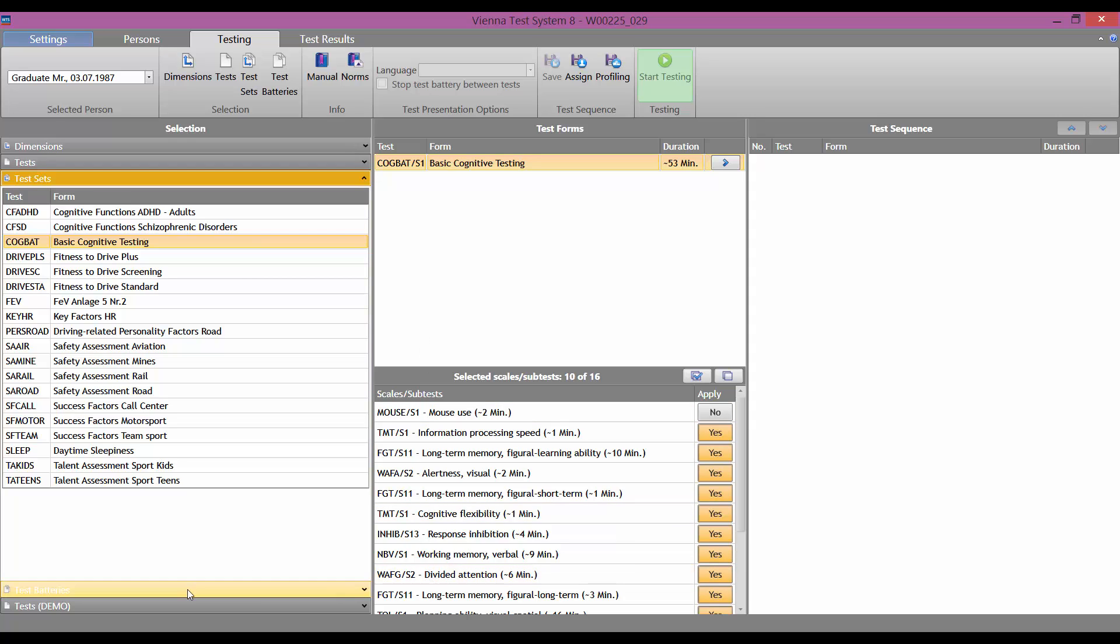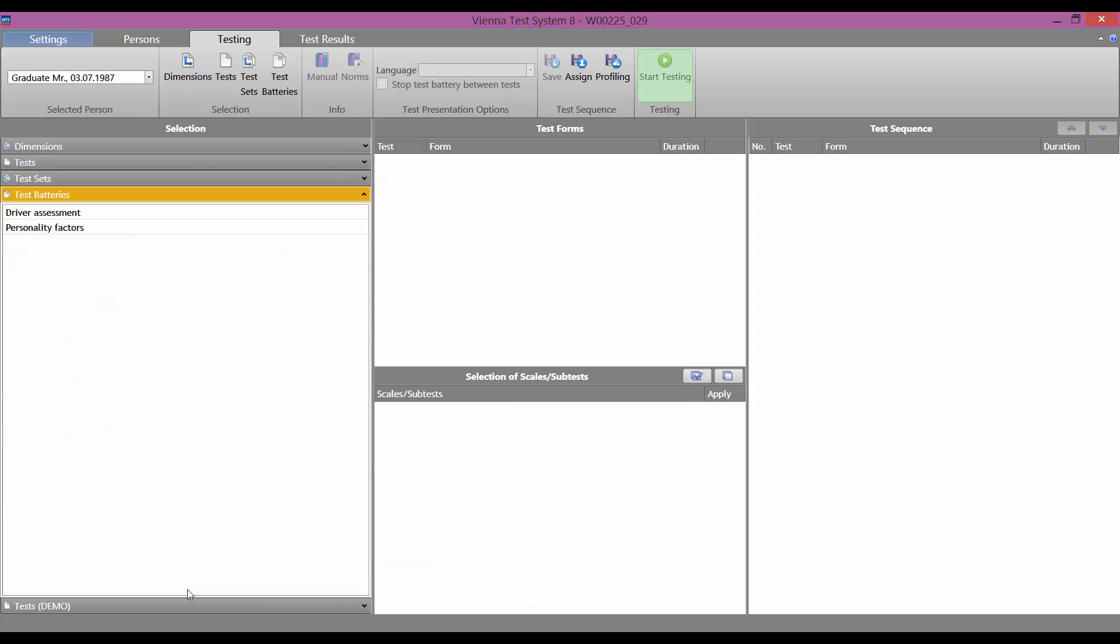And here is the fourth option. By test batteries. You can compile a series of selected tests into a test battery yourself and save it. You can then select it here, in the test batteries sub-menu.